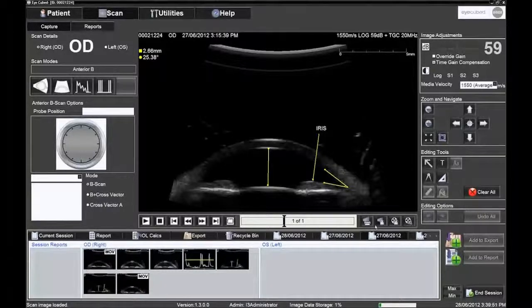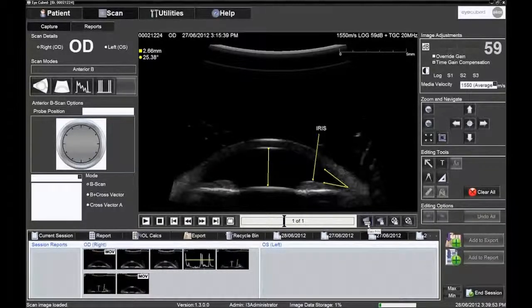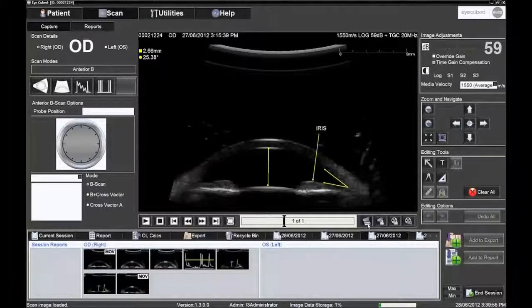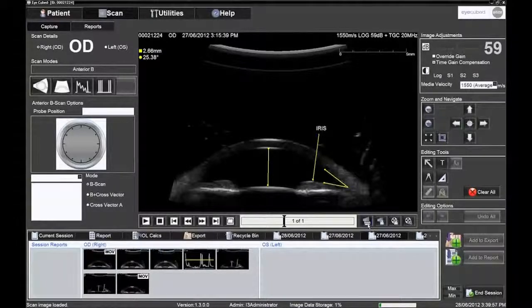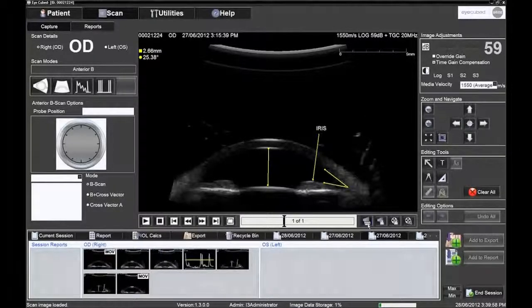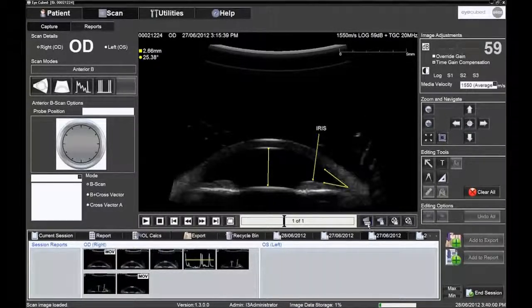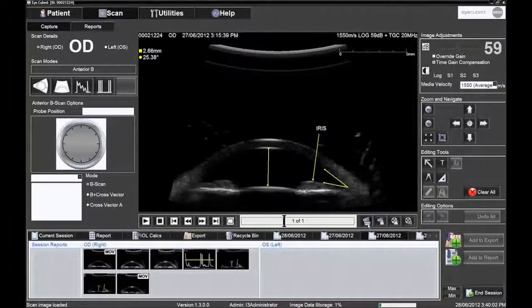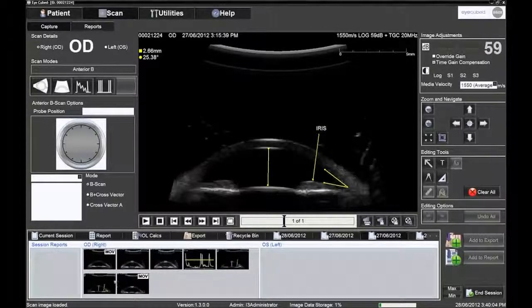The EasyPrint function allows the user to print the scan that is currently displayed by clicking on the EasyPrint icon to the right just below the scan image. To display a saved image, simply double click on the image of interest in the image tray bin.